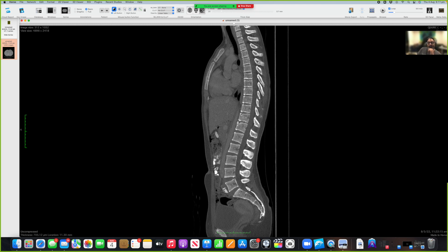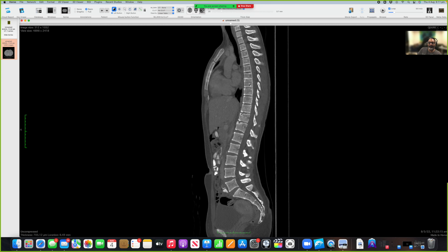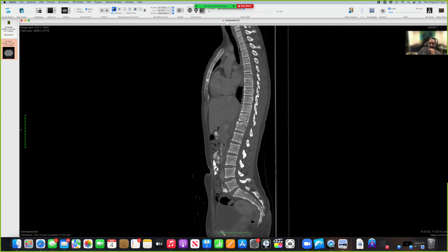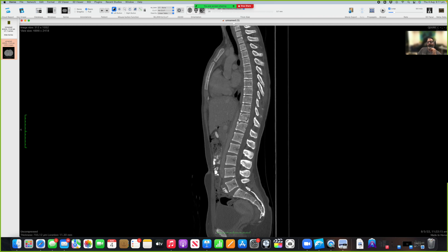Another thing to look at: you want to look at all the borders of the vertebral body and make sure they're nice and smooth. Big fractures are very obvious, but small fractures can be difficult to see. You also want to see the intervertebral spaces, which need to be nice and even - that shows you the quality of the intervertebral disc.